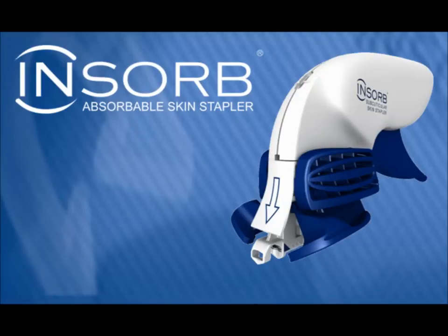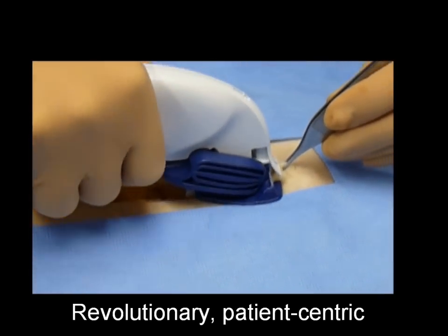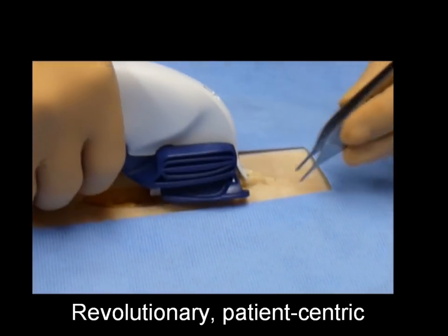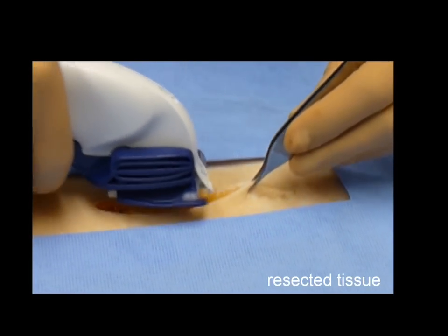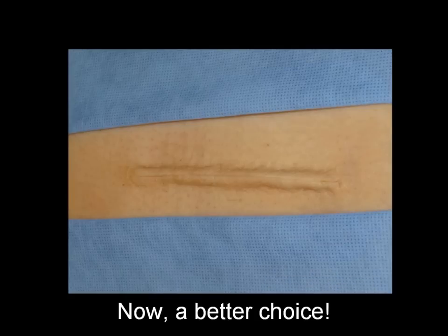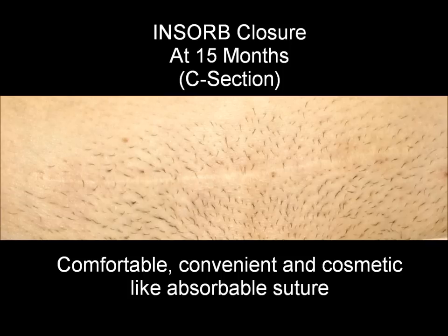The InSorb absorbable skin stapler — the absorbable new standard for skin closure. The InSorb absorbable skin stapling technology is a revolutionary new patient-centric method of skin closure. Now, instead of using absorbable sutures or metal skin staples, patients and clinicians have a better choice for closure of surgical incisions. The use of the InSorb skin stapler reduces operative and anesthesia times similar to a metal skin stapler, with the comfort, convenience, and cosmetic result of absorbable sutures.